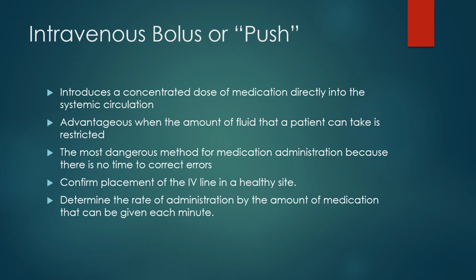If it's not in the correct location, that medication can seep into the surrounding tissues and could cause an infiltration. If the fluid is a vesicant, it could cause some bruising and redness for that patient.